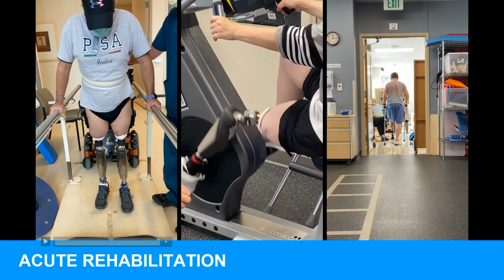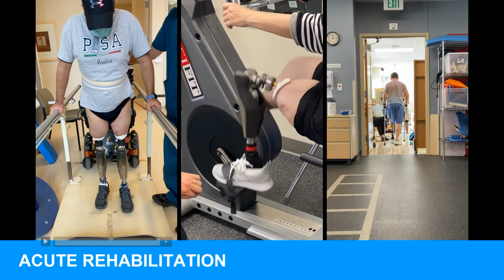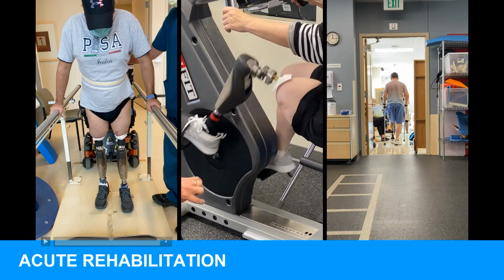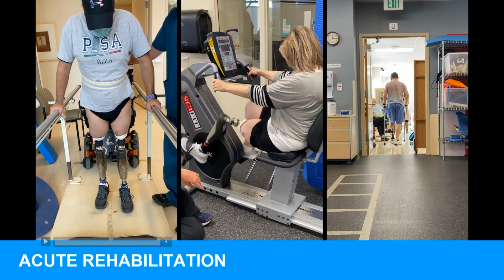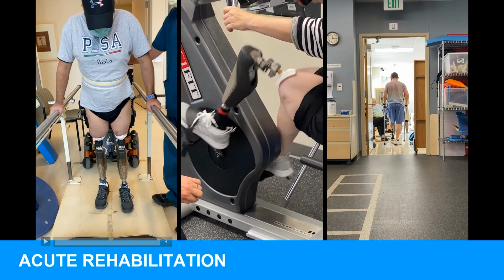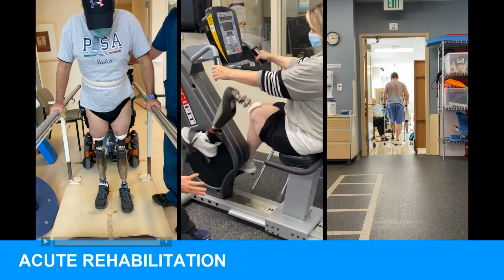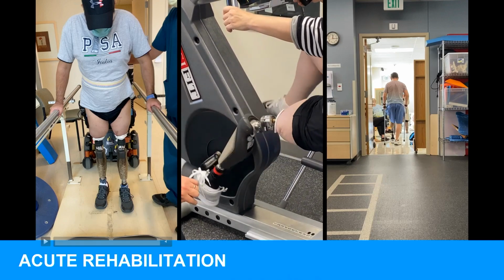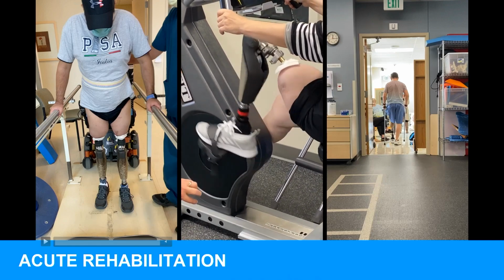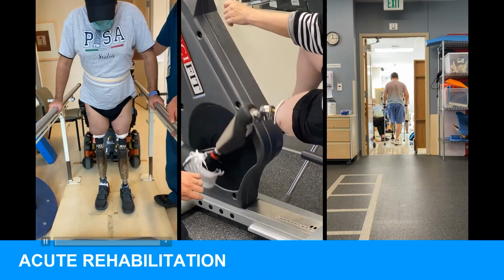We want to make sure that if they have a flexion contracture and need adjustments, that you do them, because there's nothing better than you get the frosting on the cake. When they eliminate their crutches and they're walking dynamically is when you get to have fun and do the small little tweaking. The height will be excellent when they leave us, but until they can rotate their pelvis and eliminate the walking aids, that's when you get to do your magic.